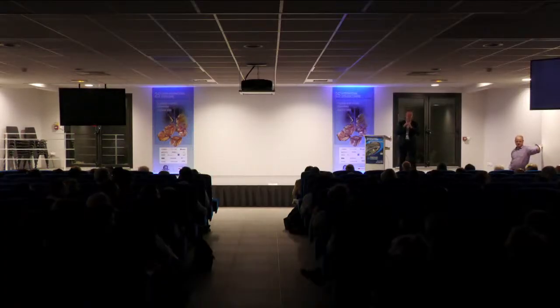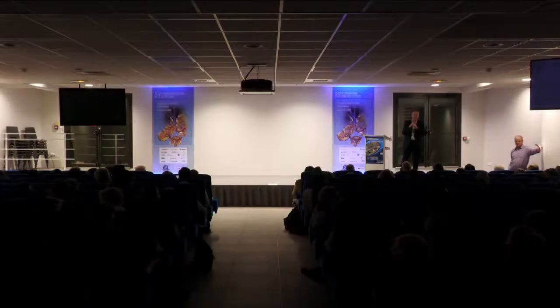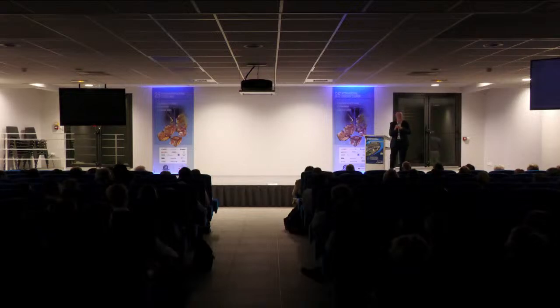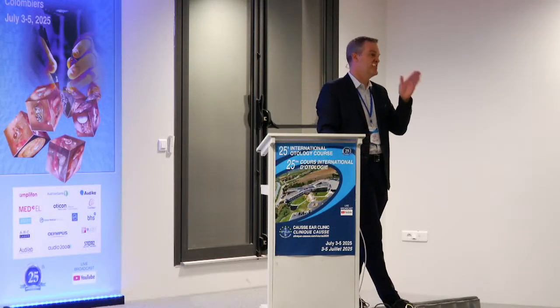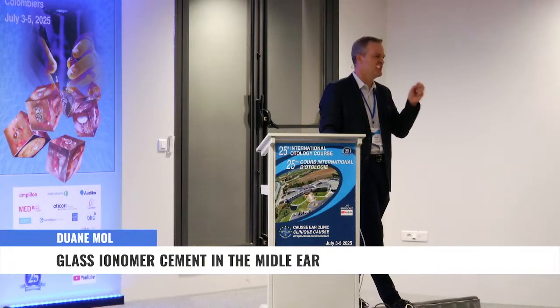If you have the defect and you have the lenticular process, do you put it on the lenticular process and keep the joint between the lenticular process and the head of the stapes intact? Or do you put it directly on the stapes? Because the surrounding is not completely dry, then you will have erosion of the stapes superstructure. And how do you get it dry? What's very interesting is that it's the one cement that we've tested that was the most favorable in slightly wet conditions.